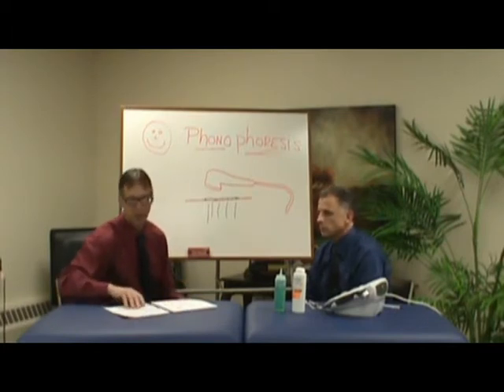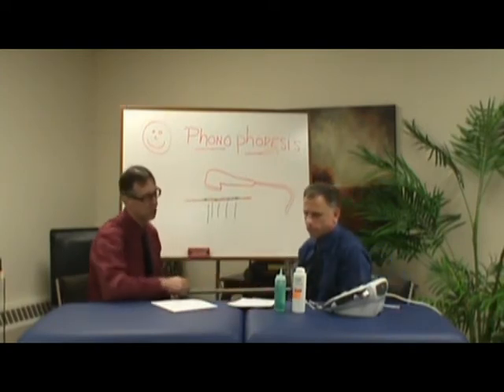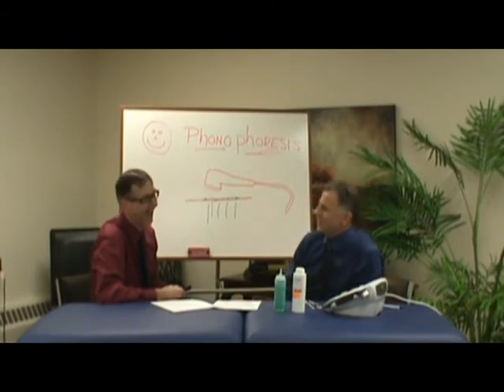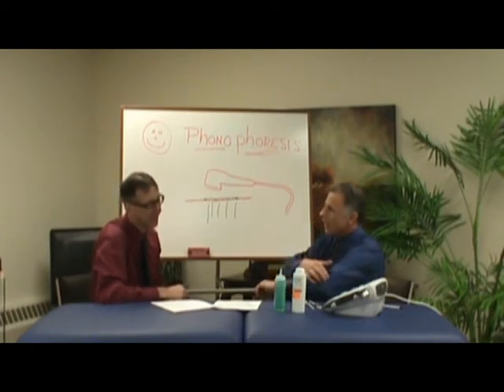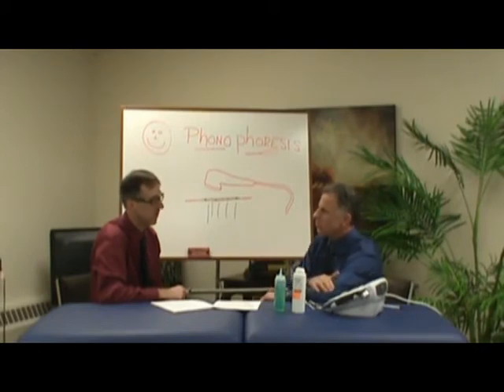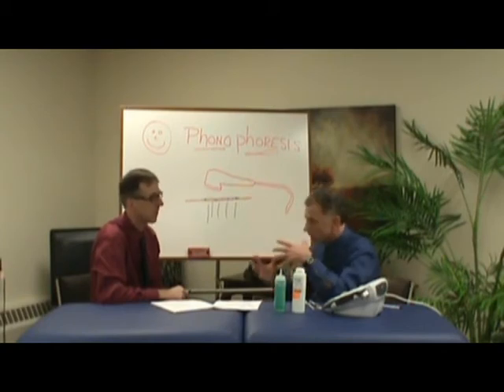Brad, since you want to talk here, what are the contraindications? Where are places that you're not going to do this? Well, I just have them memorized, Bob. Watch his eyes. When you do it close over the bone, like if you have an injury by the knuckle or on the elbow where the bone is right under the skin, I don't do it there because I've actually tested myself with that. When you ultrasound over a bone and you hold it, it's very uncomfortable, and you don't want to do that to a bone. If the person has a history of cancer in that area, you can stay away from that.